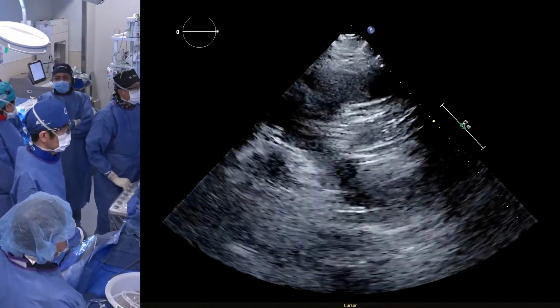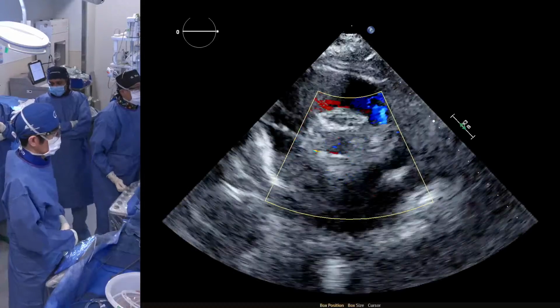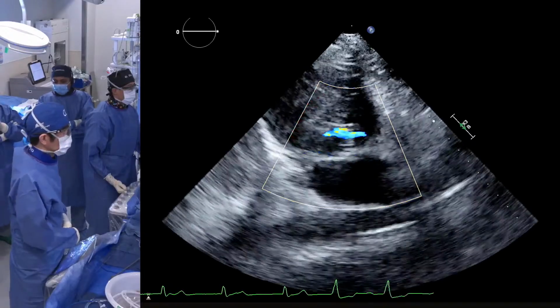Okay, what about TAVR in TAVR? No, that's the same, valve in TAVR, yeah. The valve degeneration, TAVR versus surgical. Second is the patient with a bicuspid aortic valve with a high calcium score.